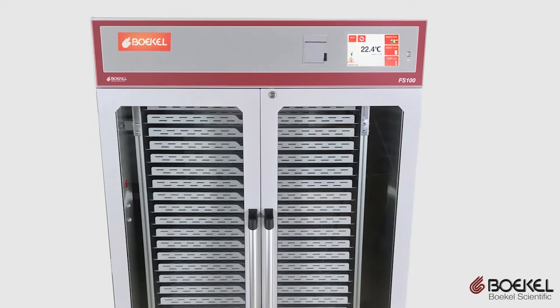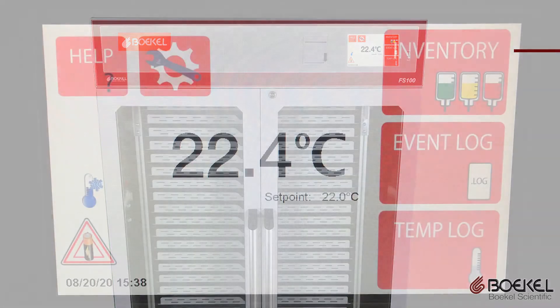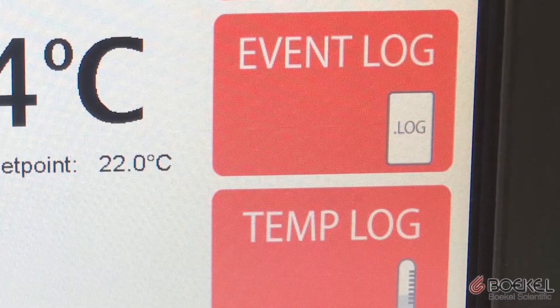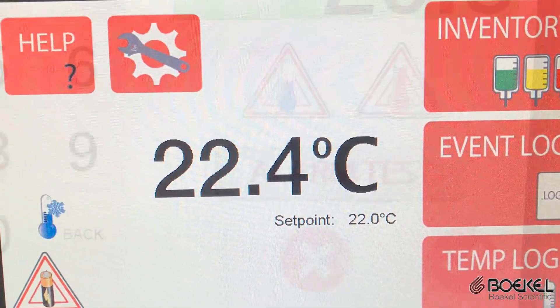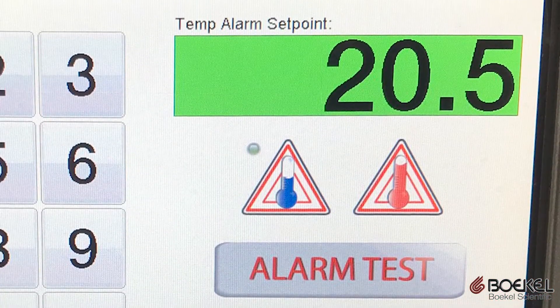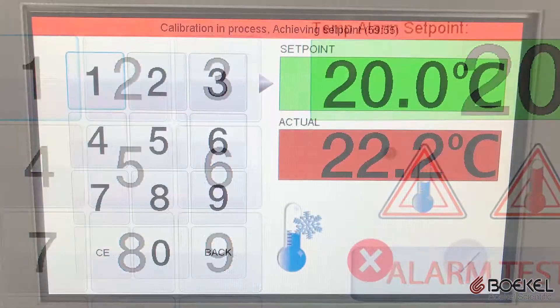The system is controlled by a large industrial-grade touchscreen controller with intuitive navigation. Bocal Scientific put years of research into creating the most useful interface for a platelet incubator. The system actively displays the most important parameters and has automated cycles for high-low temperature alarm testing and system calibration.